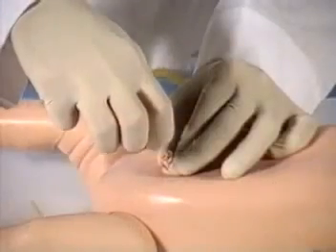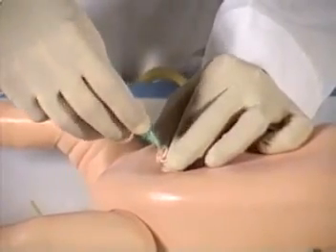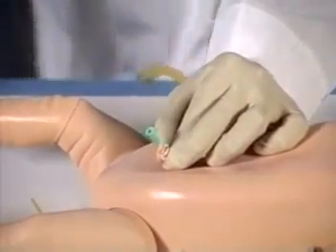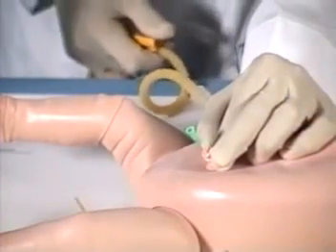In addition, the infant crisis mannequin has a unique chest skin with an umbilical cord, which allows practice of proper techniques in umbilical catheterization, including cutting and clamping. Fluid may be aspirated through the replaceable umbilicus, making this mannequin incredibly lifelike.